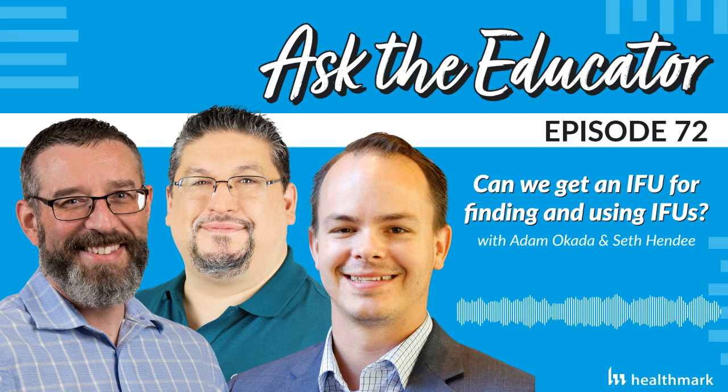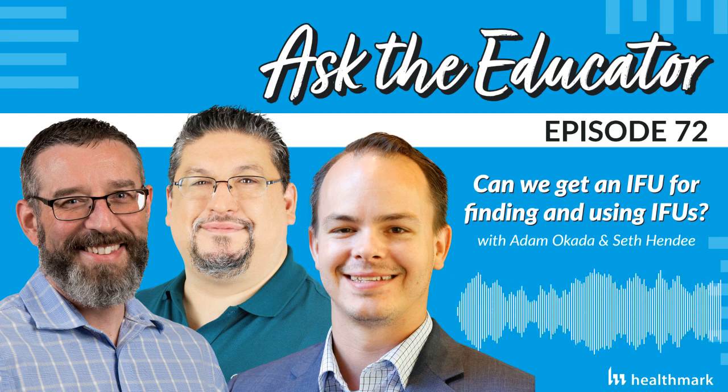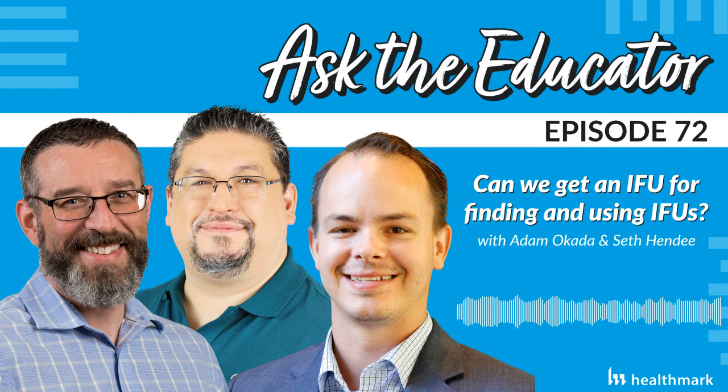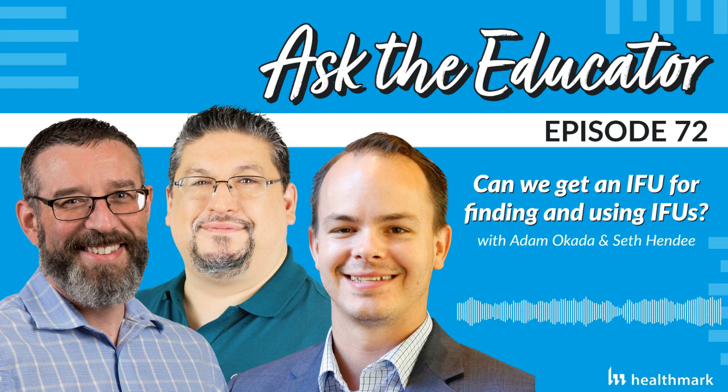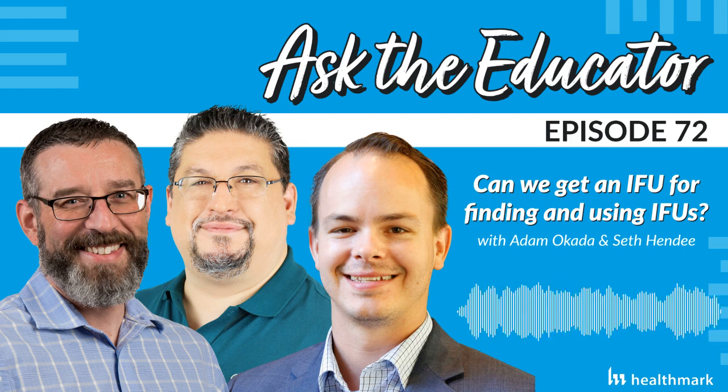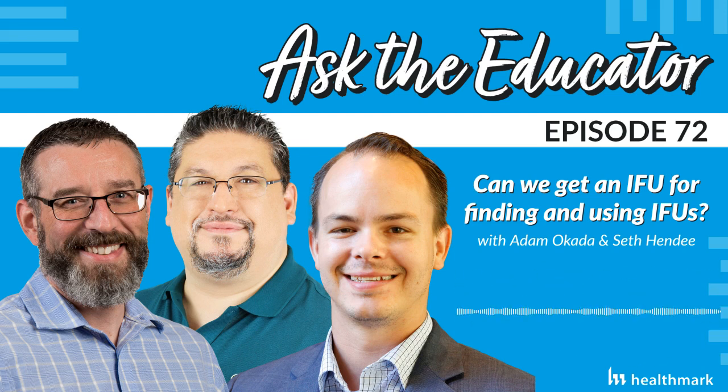One of the things that I will just share really quickly that we tried in our department that was pretty successful, I think it wasn't 100% successful. I think if it was coupled with the things that we've already discussed here, it would work even better. But one of the things we did was we highlighted an IFU of the devices that we were processing each month. They would have to do a read and sign of the printed IFU. And then we would discuss portions of it at each huddle throughout the month. So it wasn't just what are the sterilization parameters. We would be discussing all the hidden gems in there as well.